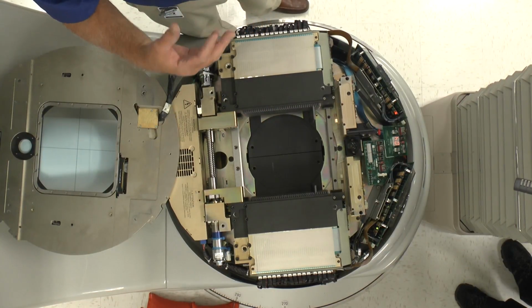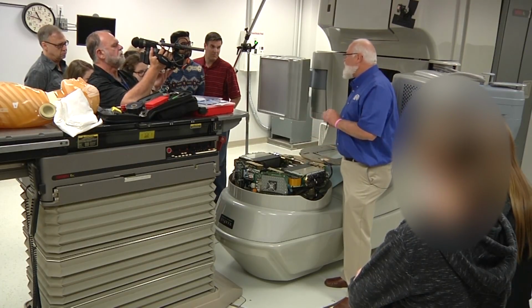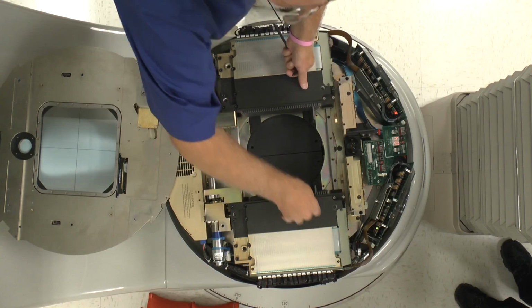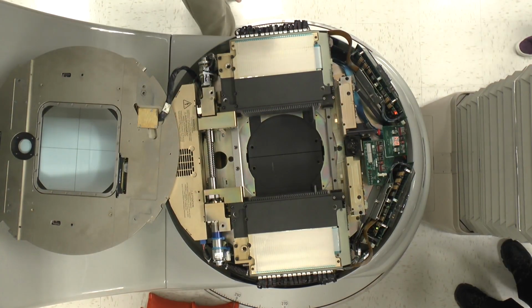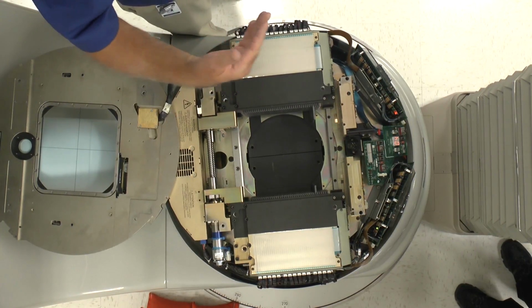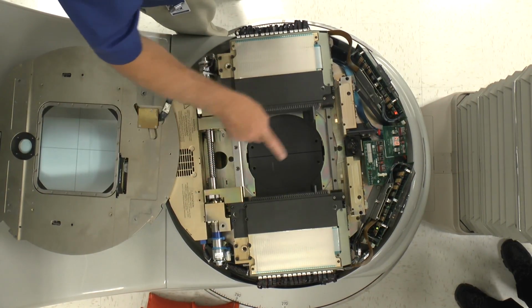If it's an older mirror, say 2-3 years old, anything you drop on it, its Mylar will just shatter. So you have a lot of tie wraps on here, and little components that are really fragile. Once you start playing in the head, those things start to break, and you may break one of those tie wraps. You may not see it, but there's a piece inside the head.